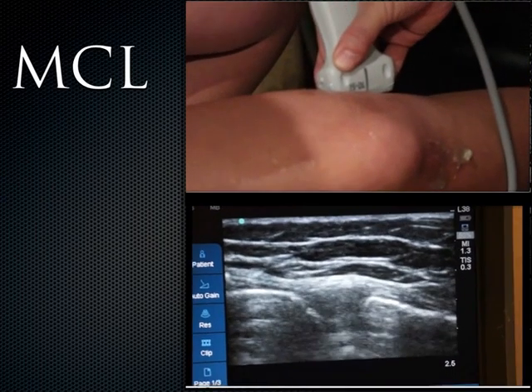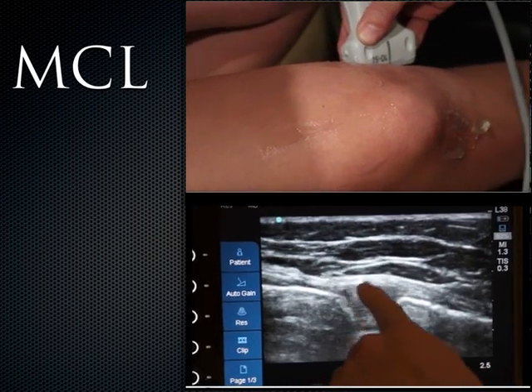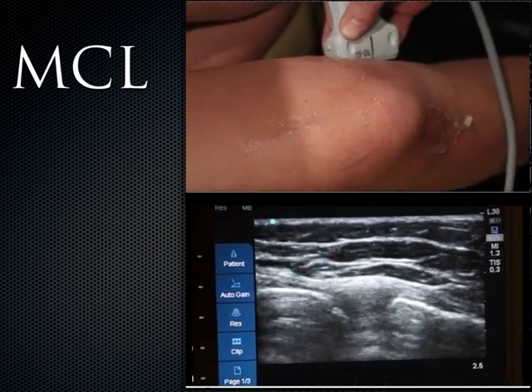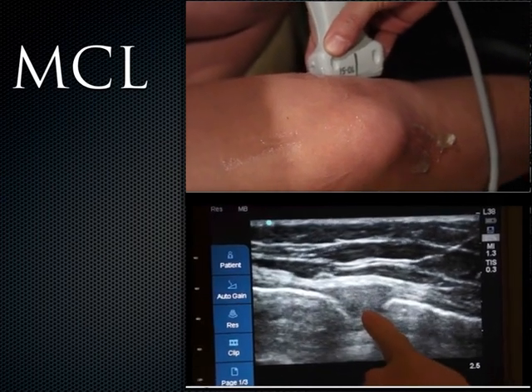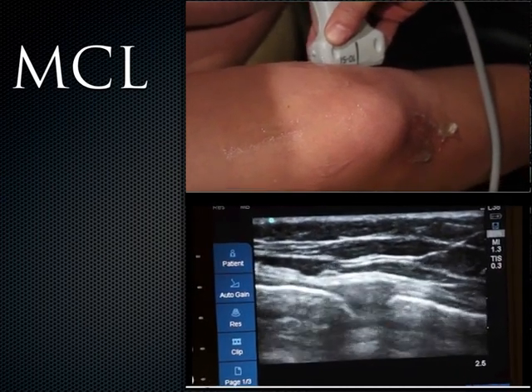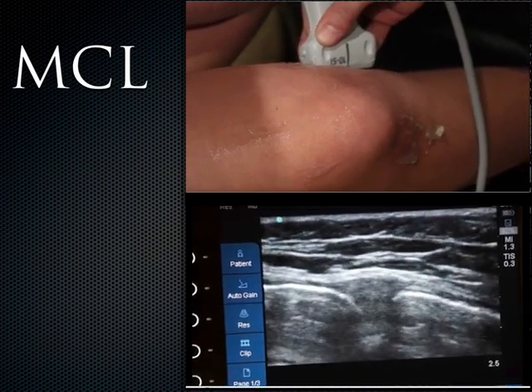So now I'm imaging the medial knee, and what I see is the superficial and deep fibers of the medial collateral ligament, and just deep to that is the medial meniscus. And here is the femur, and here's the tibia right here.